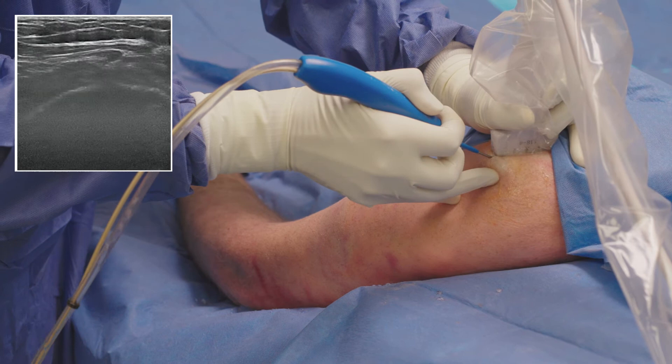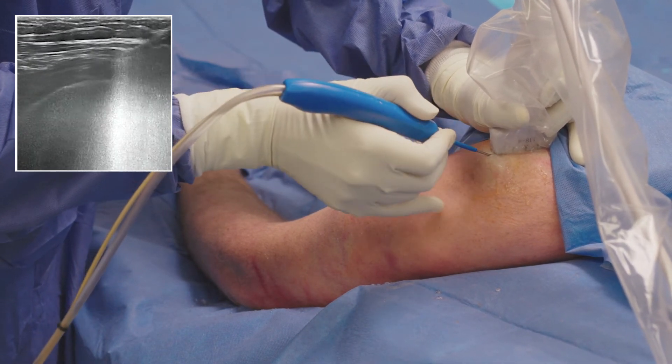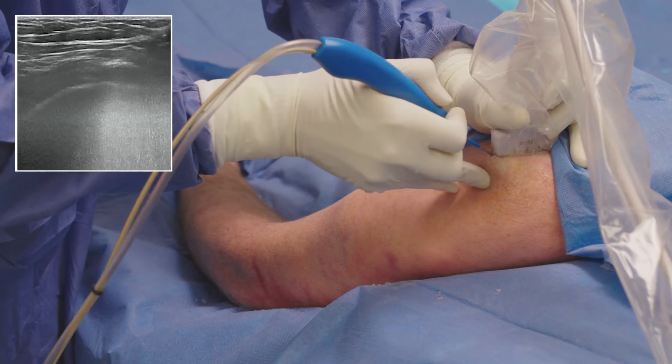When the device is in the proper position, I depress the foot pedal to deliver the high velocity stream of saline to debride and evacuate the diseased tissue from the site.